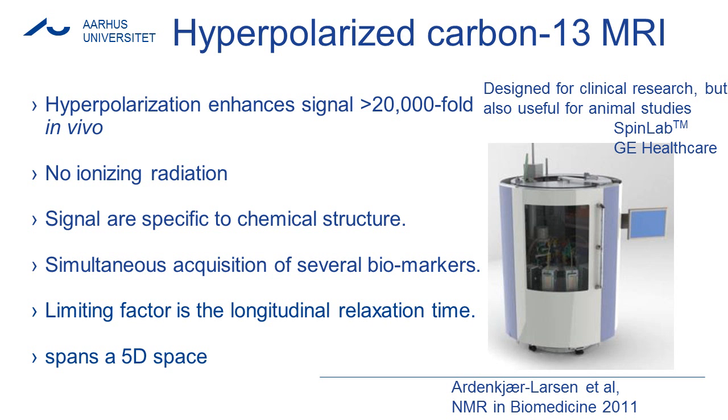I will start out by telling you a bit about what hyperpolarized carbon-13 is. In normal MRI, we rely on a contrast agent, and particularly on the indirect changes done to the surroundings by this specific contrast media. This is quite contrary to hyperpolarized carbon-13, because here the hyperpolarized agents act as a source of signal themselves, rather than just modulating the signal from the protons.